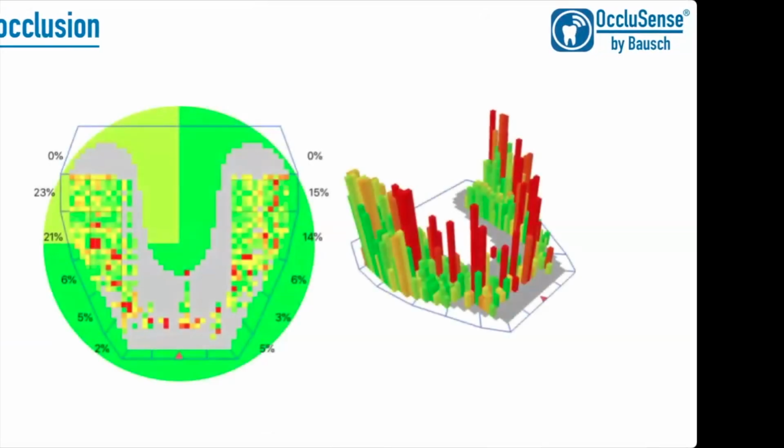If we now take a look at this example for static occlusion, we can see that in the right molar region, we barely have any red contacts. So this does not mean that we don't have high pressure located here. In fact, if we look at the scalings of the percentages on this side and the quadrants for our pressure level in this area, we see that 23 and 21%, so 44% of the entire pressure are actually located right in this quadrant. So only because there's not many red spots, it doesn't mean there's not any high pressure. It just means that we don't have any standalone or punctual contacts that are carrying this pressure.